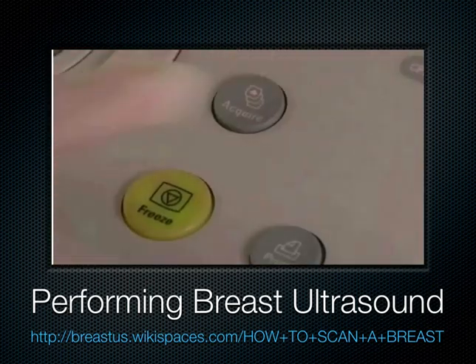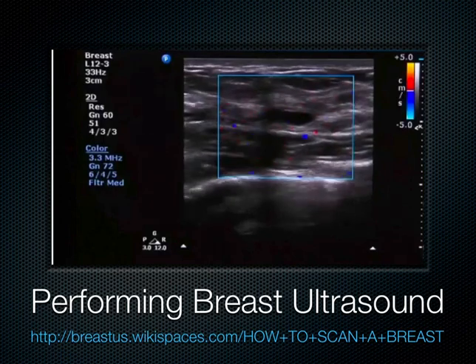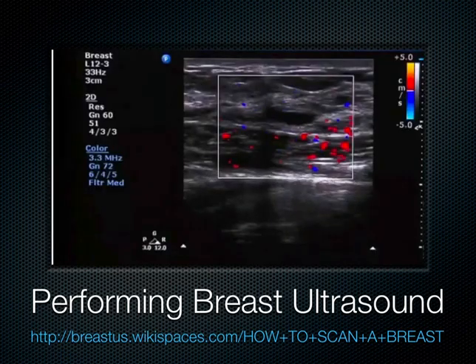Save the image and unfreeze to continue. Select the color button to obtain color Doppler images. Freeze, annotate, and save a suitable color image.